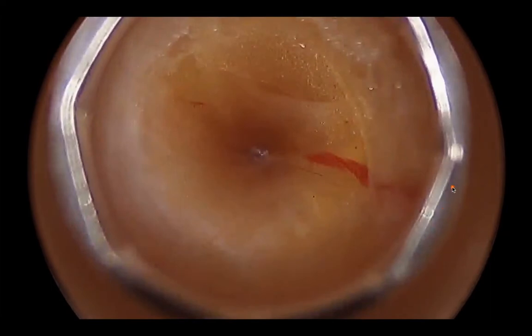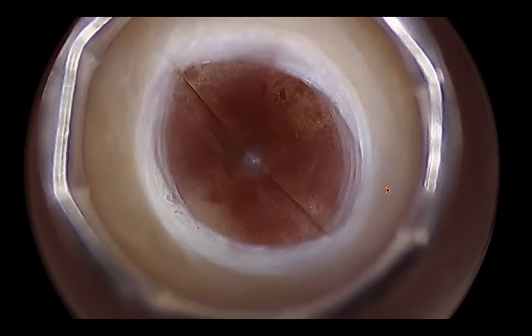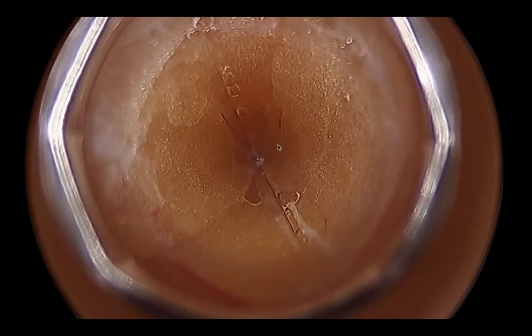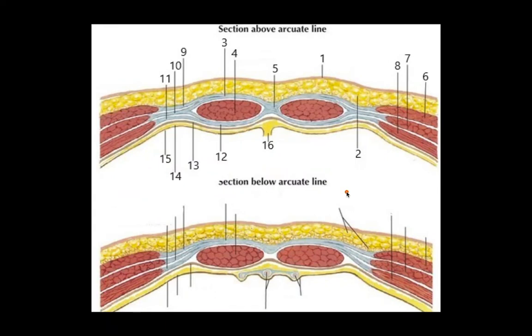Here's a video of somebody using the OptiView technique, or optical trocar technique. A nick has already been made in the skin, and this is the pointed tip of the trocar we're looking through, resting in the subcutaneous tissue. We keep going through all the subcutaneous fat. Now we start to see the white anterior rectus sheath and then the pink/red rectus abdominus muscle. We push through that and then we start to see the posterior sheath. It pops all the way through until we're resting in the abdominal cavity — the tip is probably sitting in the omentum or some other fatty structure. The surgeon feels comfortable this is in the abdominal cavity and pulls the pointed end of the trocar out to start insufflating.